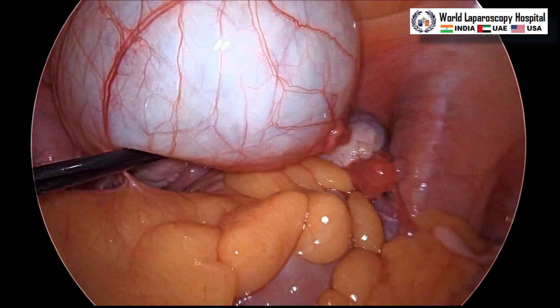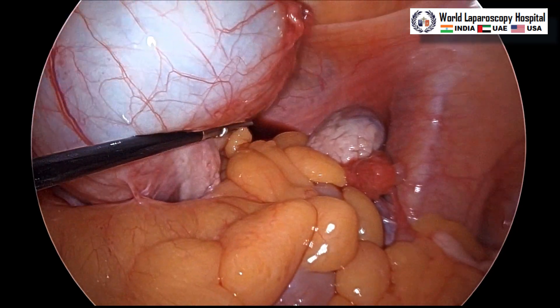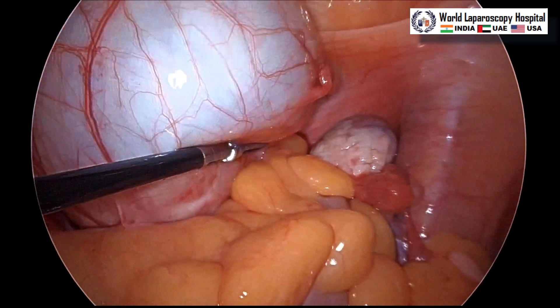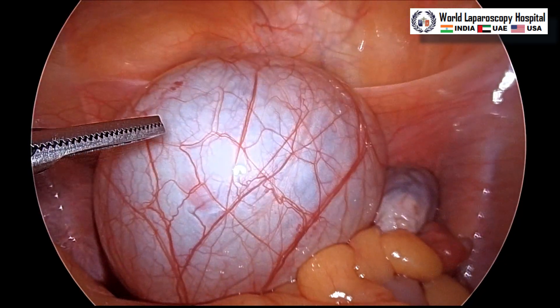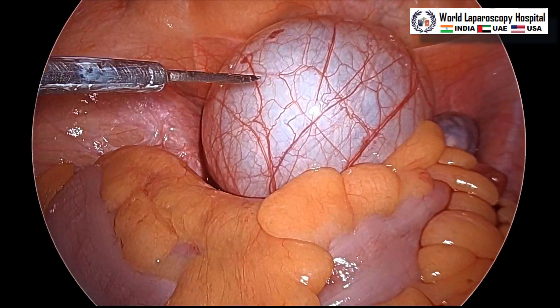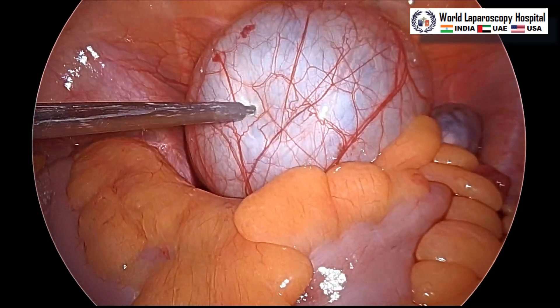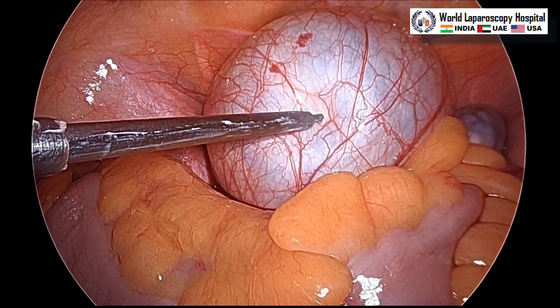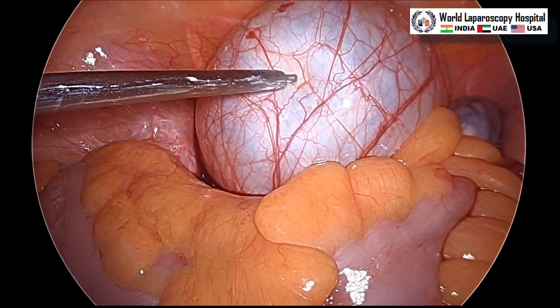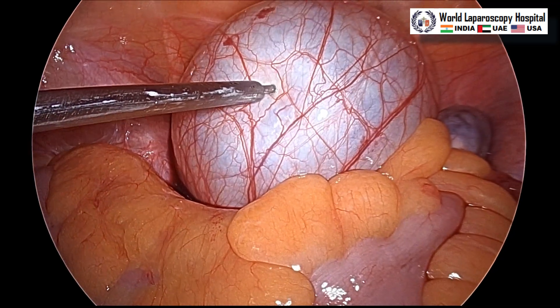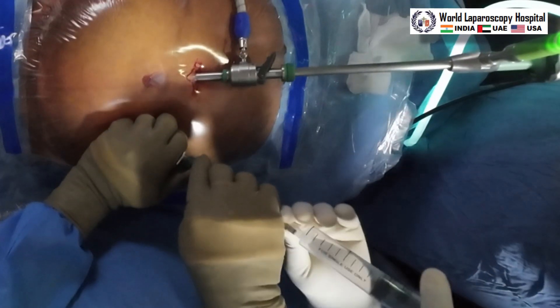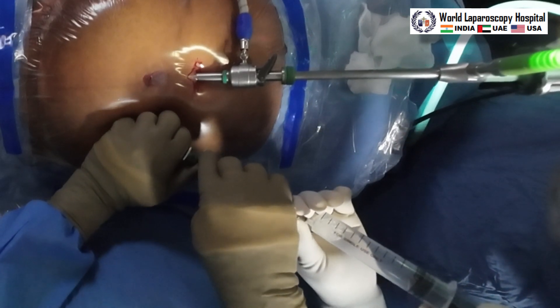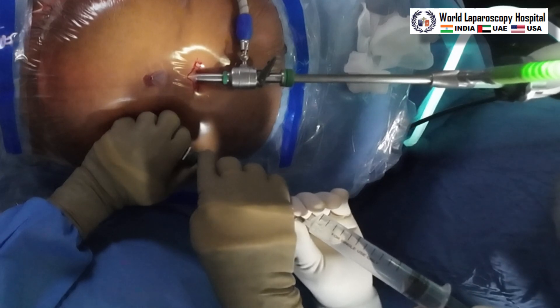In a large cyst it is important to first aspirate it. We are confirmed with the initial CA-125, LH, FSH, estradiol, CEA, and other tumor markers — all completely normal. We are aspirating it here, and we can see the consistency of the fluid. Clear, watery fluid is coming into the syringe of the aspiration needle.